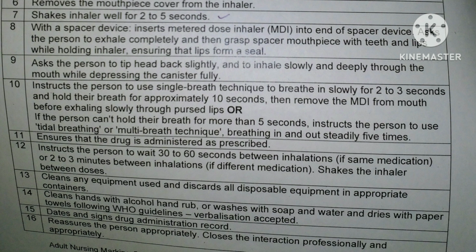Then there are two methods we can use. If the person is able to hold their breath for more than 5 seconds, we can use the single breath technique. If they are unable to hold for more than 5 seconds, we will use the tidal breathing or multi-breath technique.